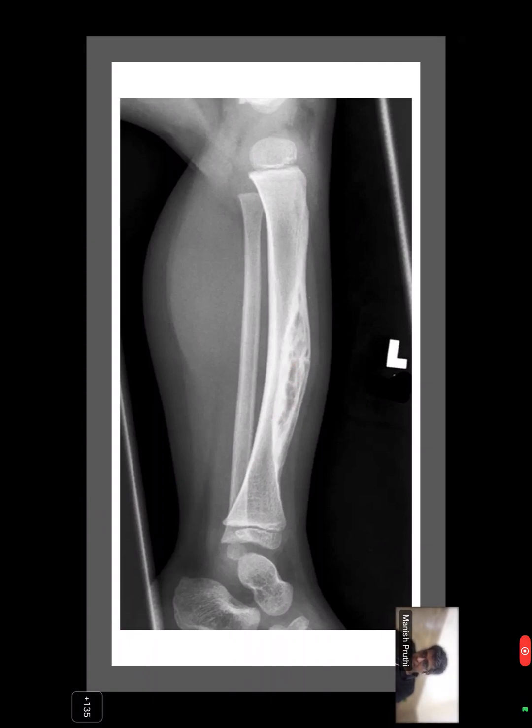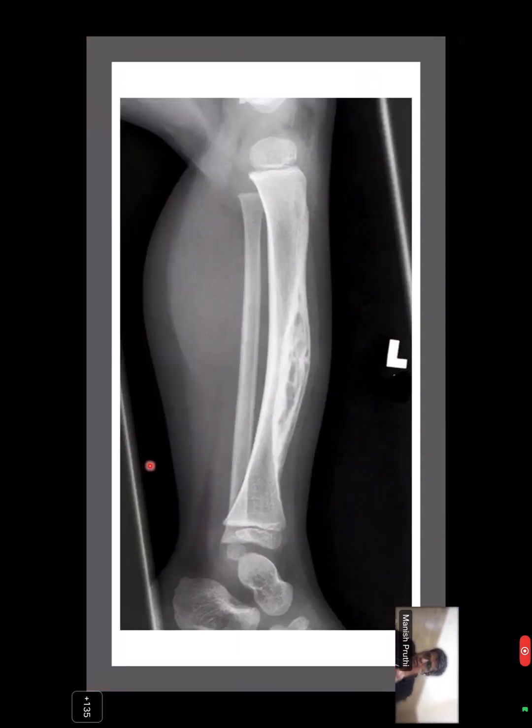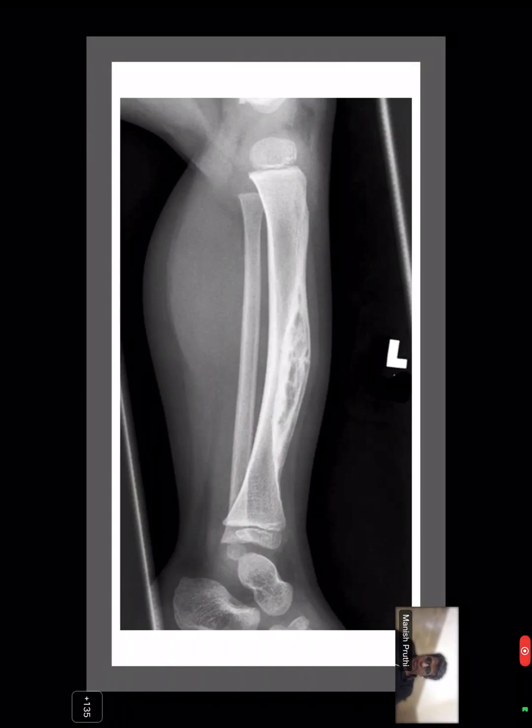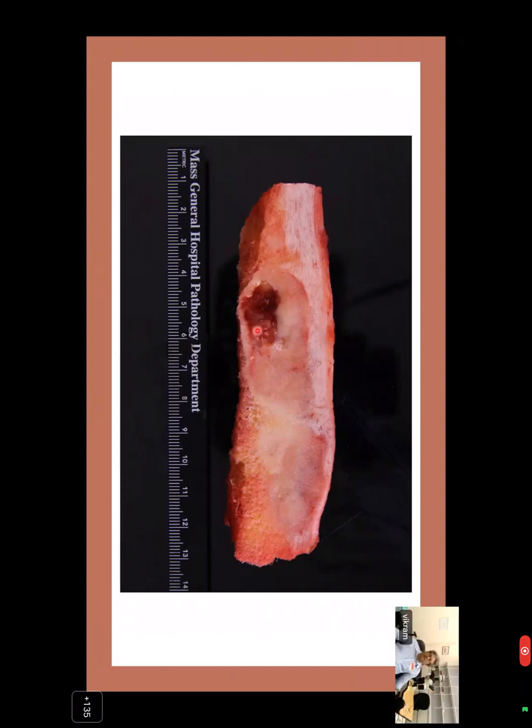Yes, in a very young child, because if you see this tibia, it is a very small tibia. This is the anterior cortex of the tibia. It looks like some 5 or 6-year-old child. You can see the length of the bone, just making a wild guess, because the talus and calcaneum also look very small. So what do you feel? A cortical lesion in the tibia with some bowing of the bone, whether benign, locally aggressive or malignant. It looks like a benign description, but it was locally aggressive in the anterior cortex, and it had this sort of fleshy appearance.